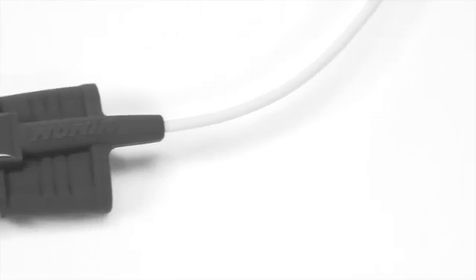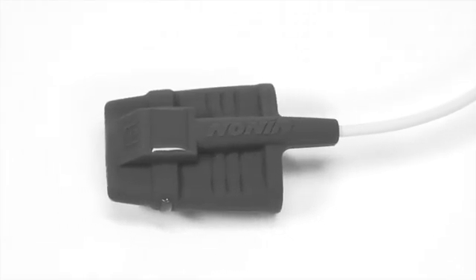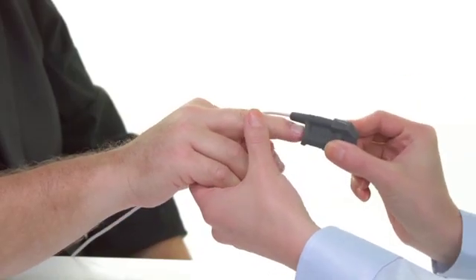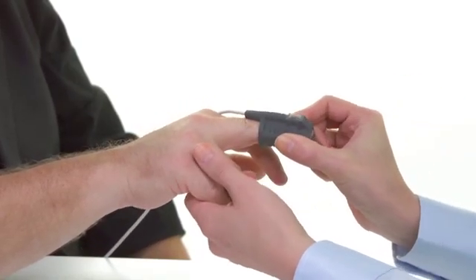Nanan soft sensors are made of latex-free soft silicone material for durable, easy placement. They are designed for easy and secure placement as well as frequent removal and reuse.